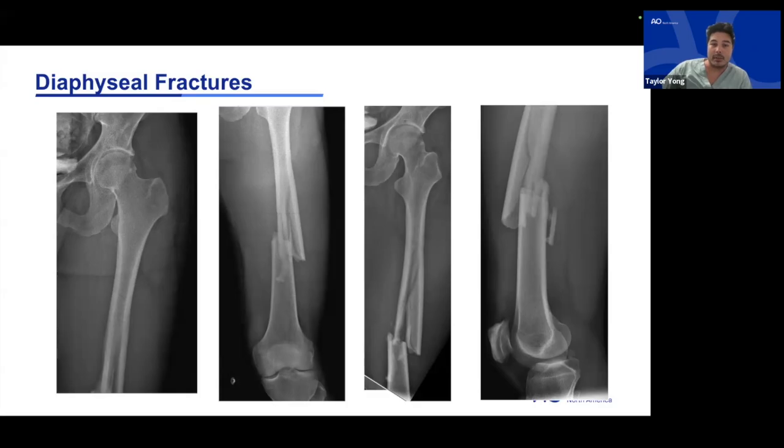And in this case, obviously, we all know, but so the students know, that if you're asked about this on a rotation, you'll probably get some bonus points if you say, oh, then I want to look at the femoral neck to make sure there's not a femoral neck fracture, because there's an association between femoral shaft fractures and femoral neck fractures. And depending on the institution, I know Patrick's getting an MRI to see if there's a femoral neck fracture, but a lot of the rest of us are getting fine cut CT scans.